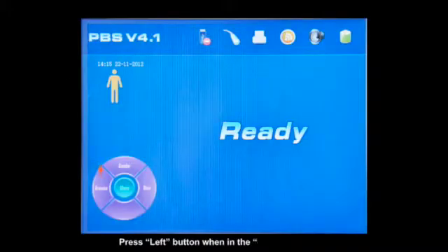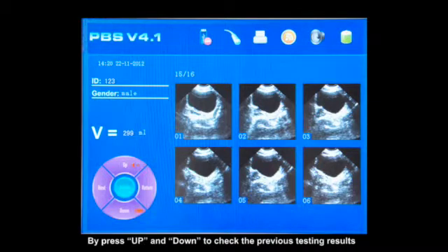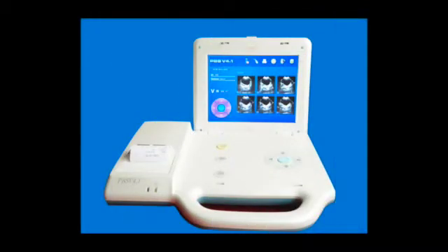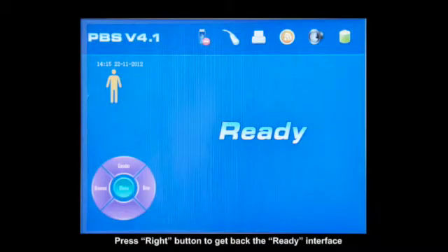Press the left button when you're in the Ready interface. Press the up and down button to check the previous testing results. Then press the print button to print the reports. Press the right button to get back to the Ready interface.